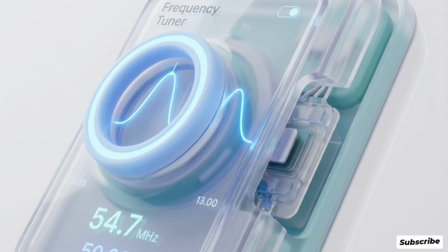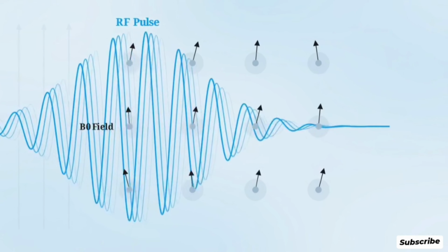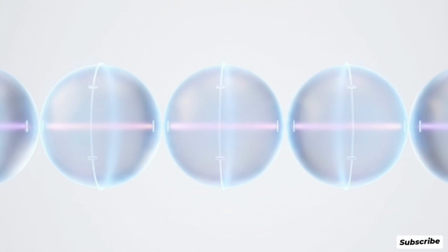It does this by firing a radio frequency, or RF, pulse that is tuned to the exact wobbling frequency of the protons. In a process called excitation, the protons absorb this precisely matched RF energy. The physical impact knocks them away from their vertical alignment, tipping them 90 degrees onto their sides into a high-energy state. This forced, unnatural posture is a temporary setup.